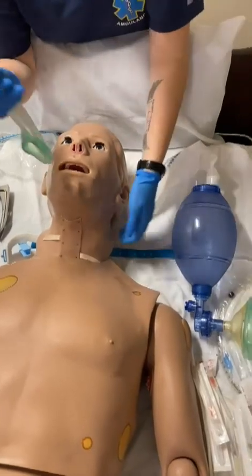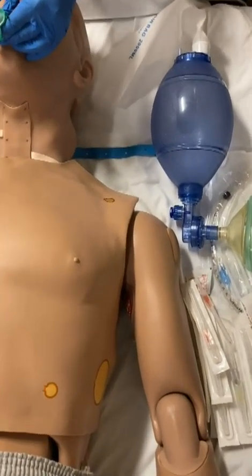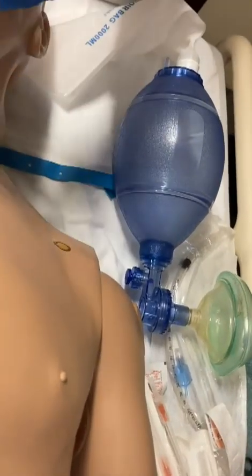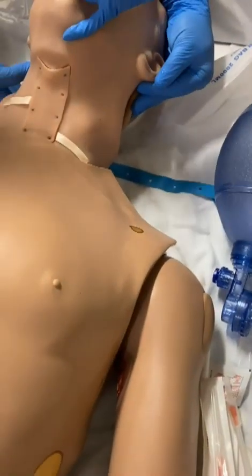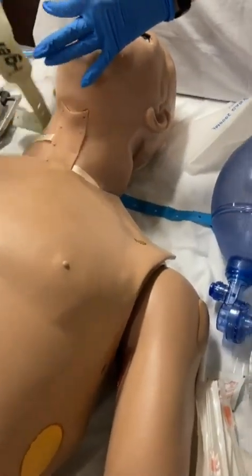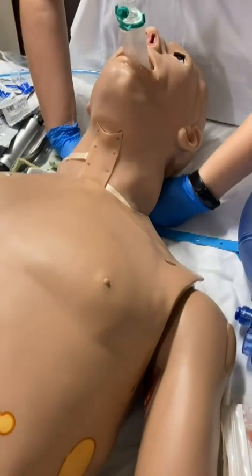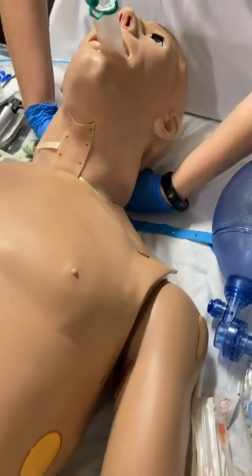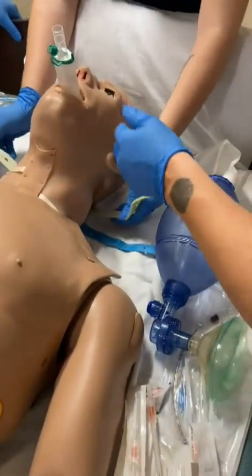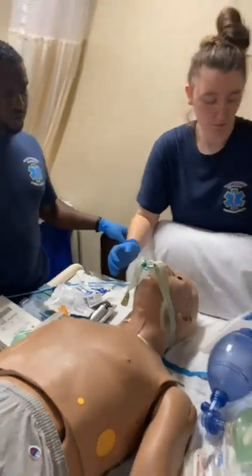Once you get the position you need — the divot goes over the tongue, you go over, you go down. See this black line? That is supposed to be at their teeth. On mannequins we might have to use the tube tamer to help support it. You don't want it to come out. If you let go, it's not going to fall out — you'll just have to push it back down. Prep is to maybe have this ready in place. Whoever's at the airway — that's their whole job — and you as the support partner have to manage that.